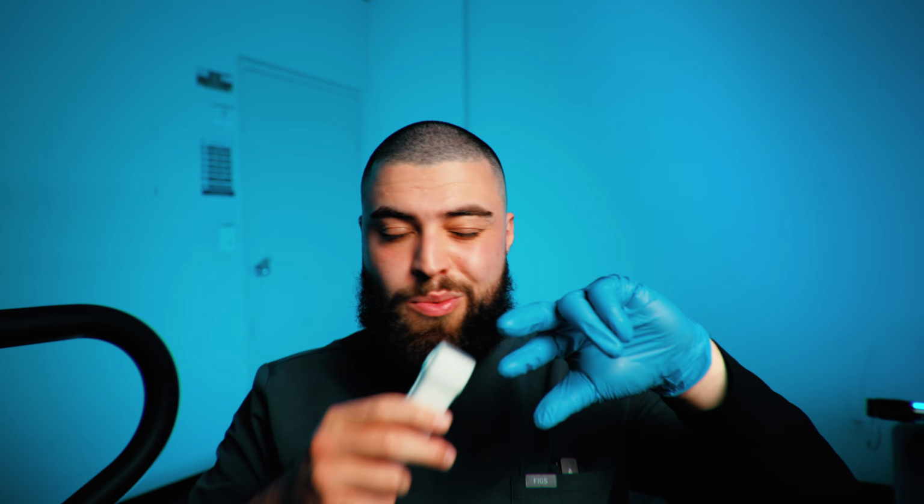So that's our subcostals all finished. And I want you guys to focus on a really important point here. Because of the amount of time that I have wasted as a trainee trying to get parasternals and apicals done and there's nothing there. Look, the patient may be large. They can have small rib cages where even pushing the probe down isn't going to help at all. I guess the point is we were being creative here.